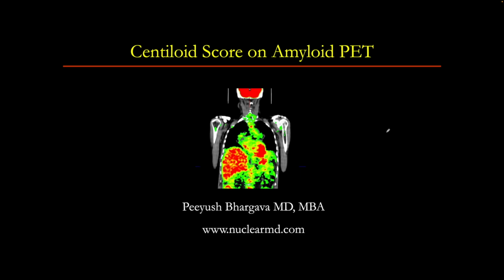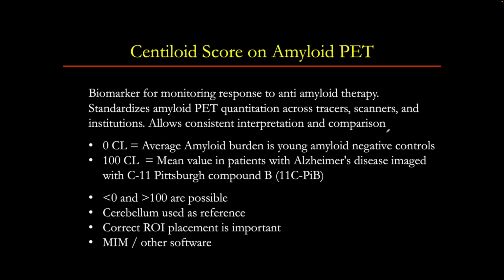Hi, this is Dr. Bhargava, and this short video is about Centiloid Score on amyloid PET scans. So Centiloid Score is a biomarker for monitoring response to anti-amyloid therapy. It standardizes amyloid PET quantitation across tracers, scanners, and institutions, and it allows consistent interpretation and comparison.